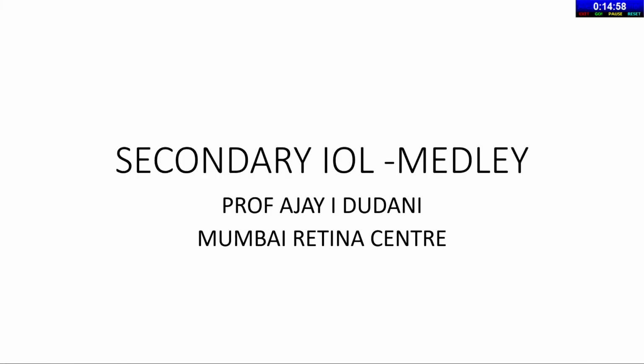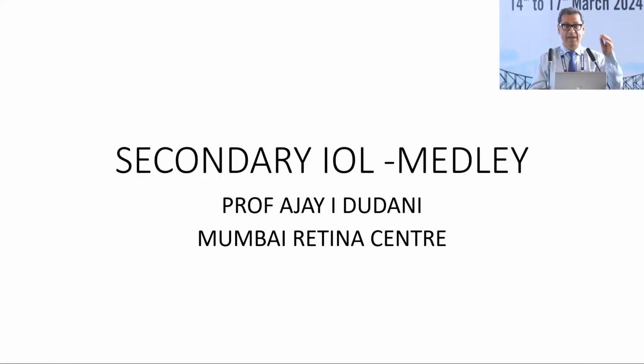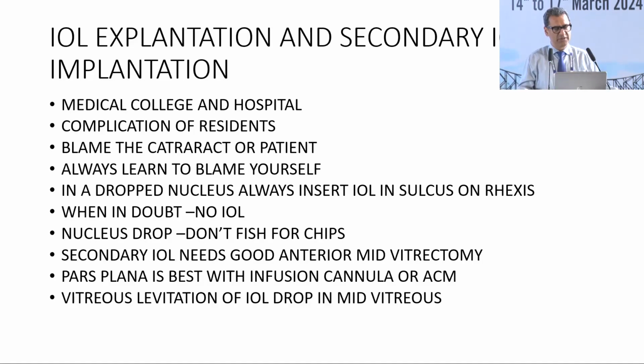This talk is on secondary IOLs. It's a medley of cases I've put together. I'm actually a professor at a tertiary medical college, so I have a lot of my complication patients. I'm not saying that we all have a learning curve, so sometimes I get stuck up with these cases. Usually I have a few takeaway points.